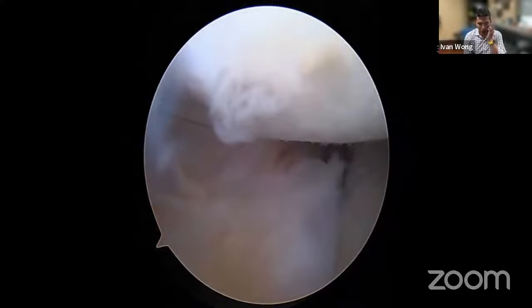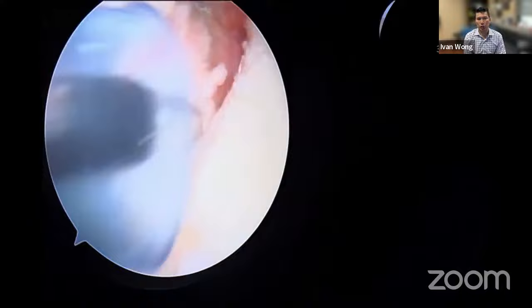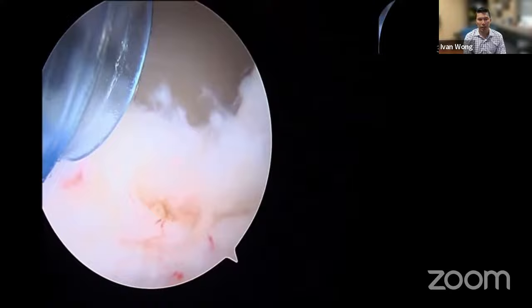We exteriorize the sutures outside of the cannula. Now I have good control — a snap or grasper holds the traction suture taut outside onto the skin. This means the traction suture is under tension externally while we proceed with the next steps.